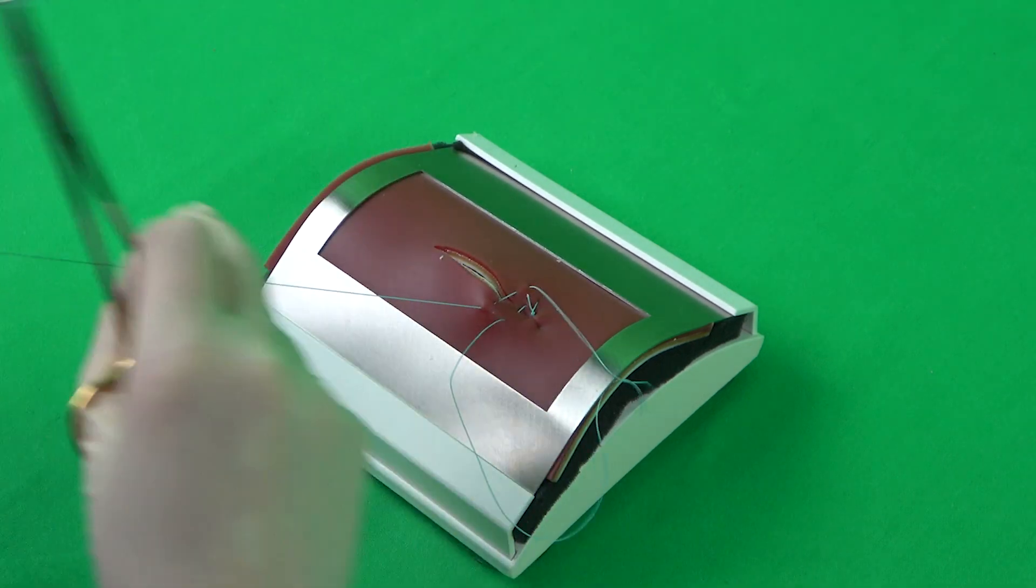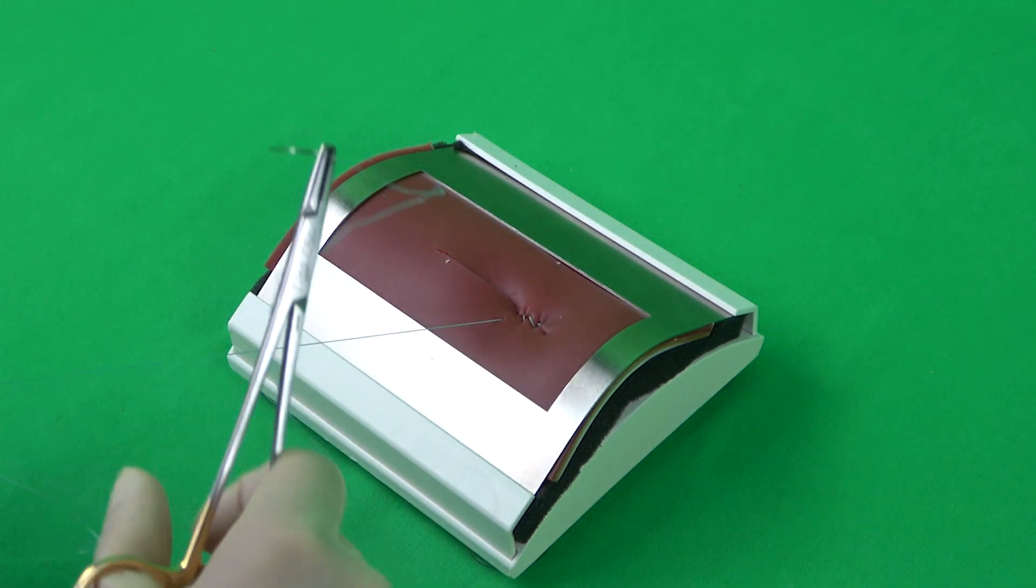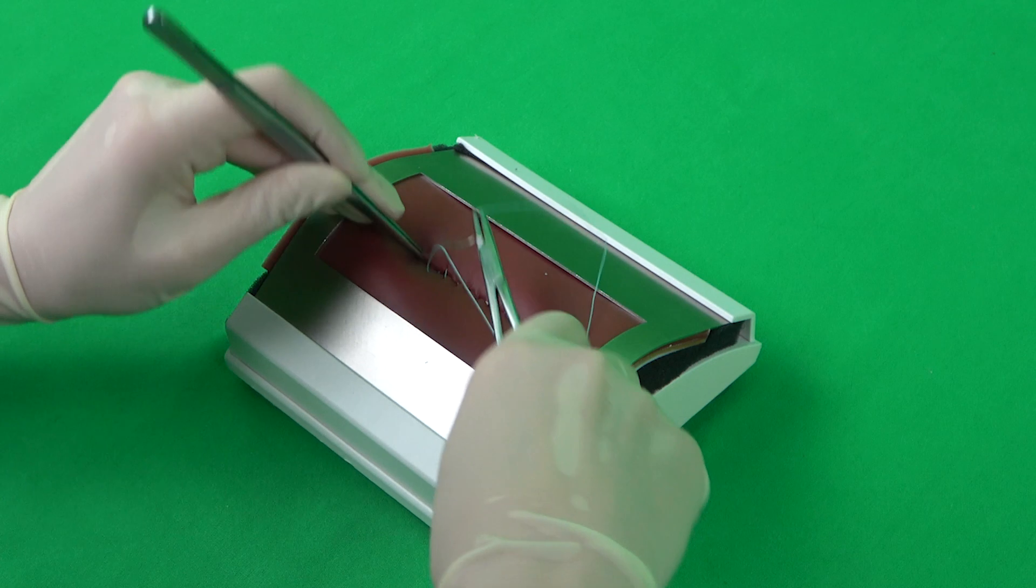After each stitch, the tissue is compressed carefully without endangering fingers or with the help of a swab. Ideally, this provides constant tension of the thread, creating a good wound closure.